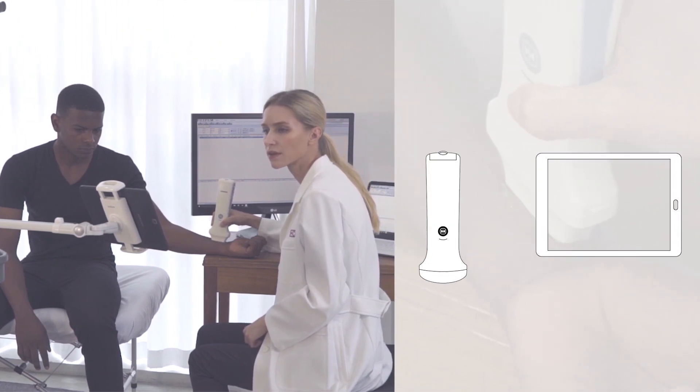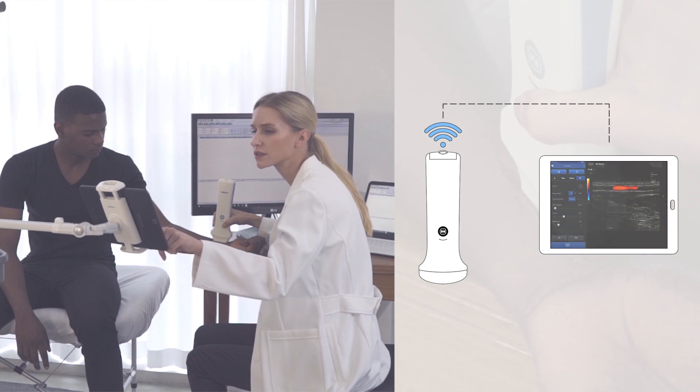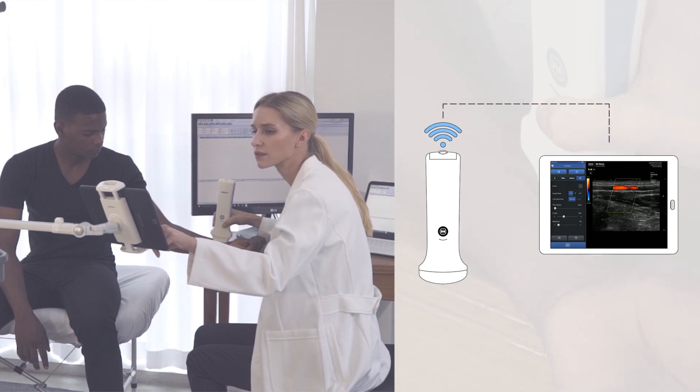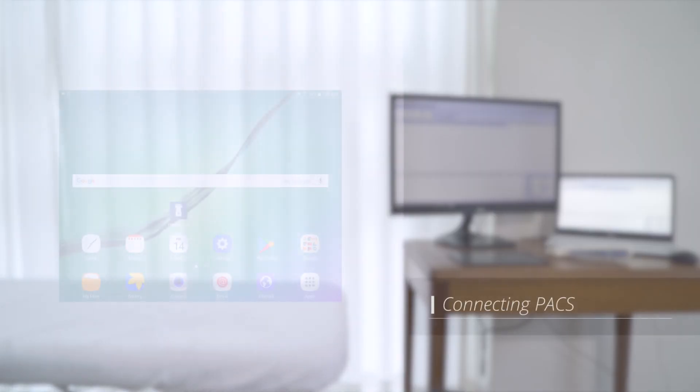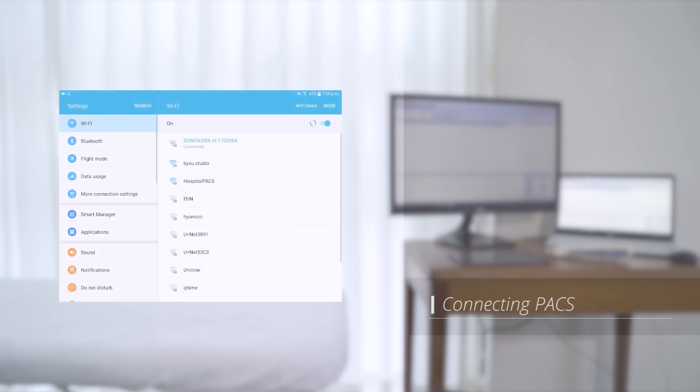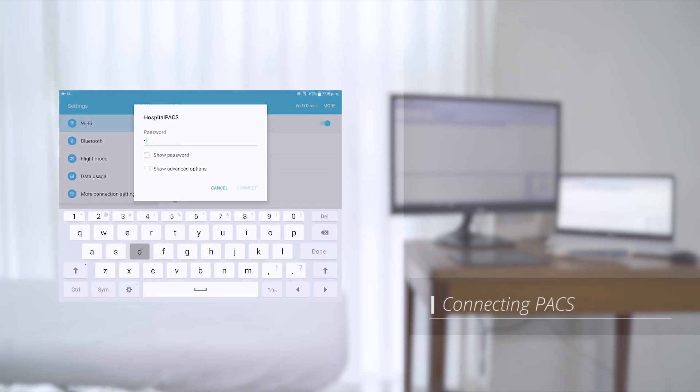Sonon generates its own Wi-Fi and connects directly to the mobile device. You can also select Wi-Fi network to connect with PACS in the hospital for PACS connection.